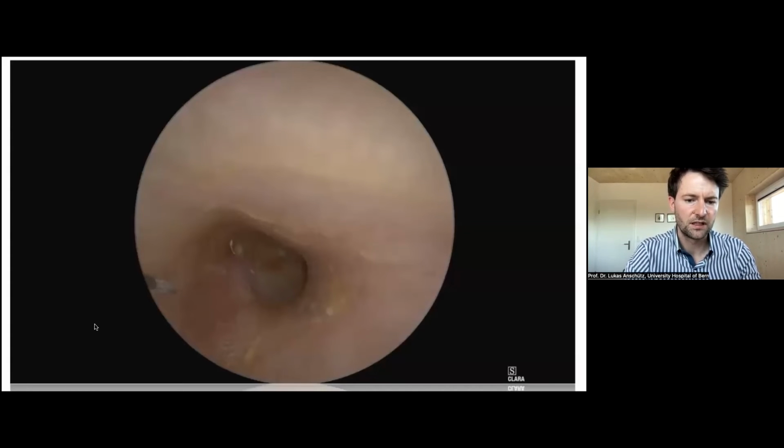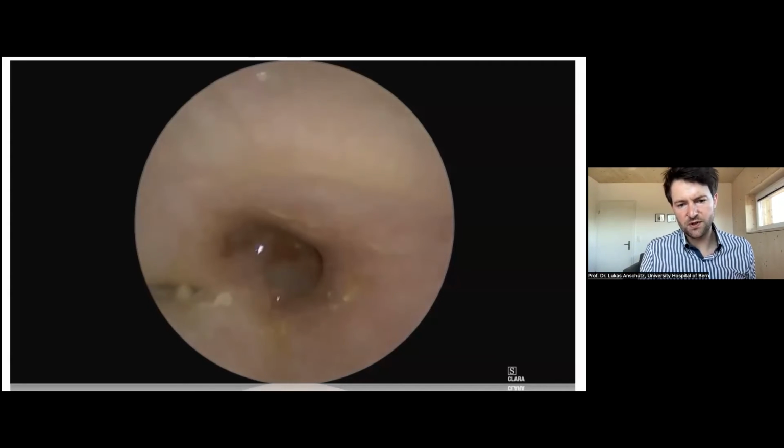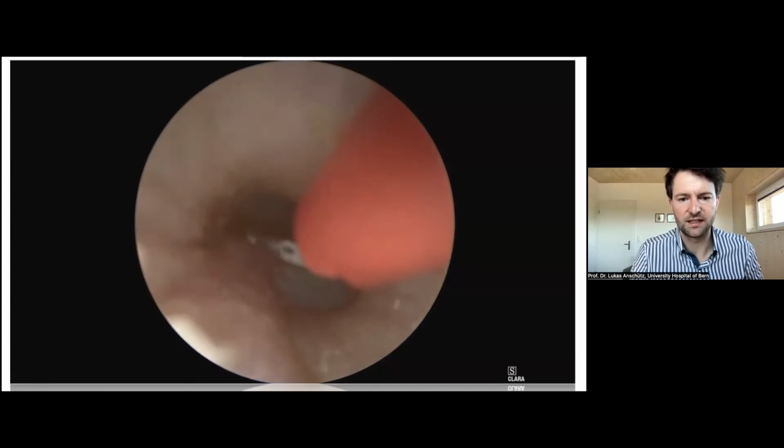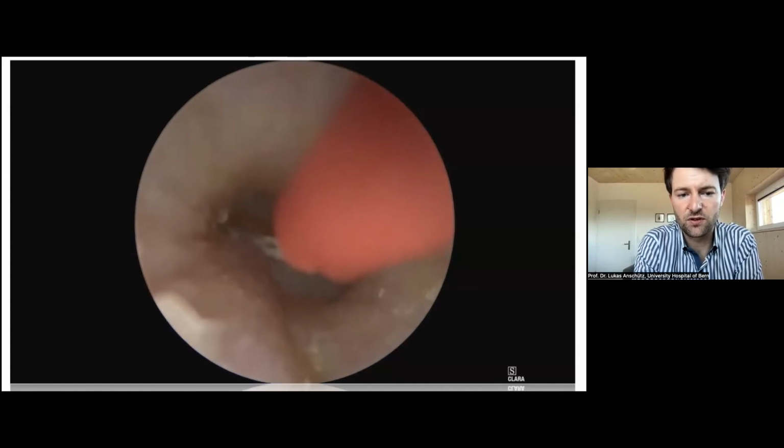So this is now the endoscopic approach for otosclerosis. You see the beginning is always the same. Of course, with stapes surgery, the flap and the elevation and the dissection of the middle ear is the easiest because there is no inflammation, no granulation tissue.